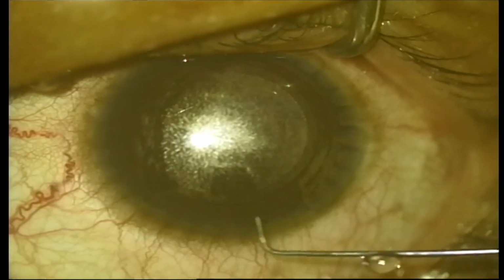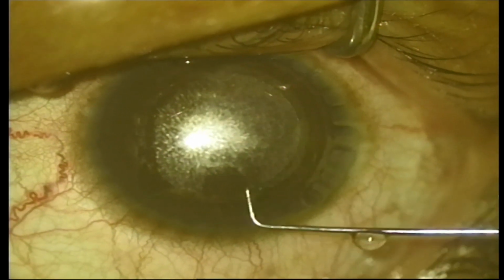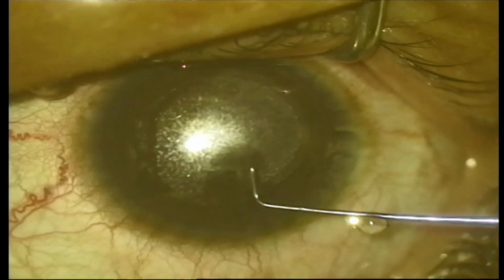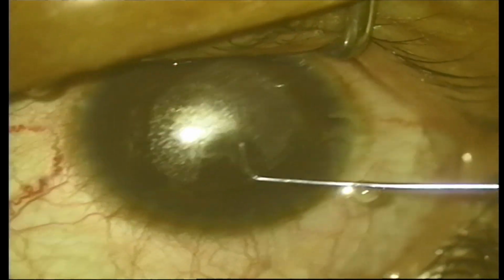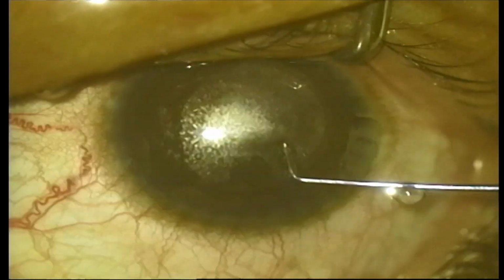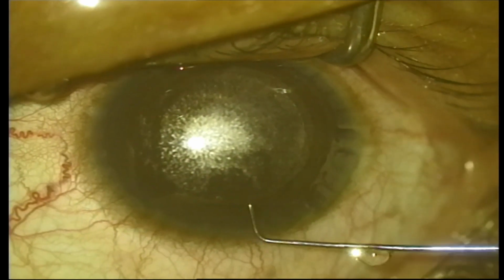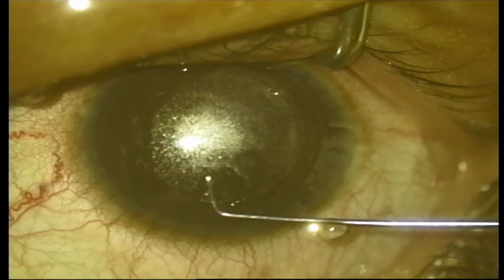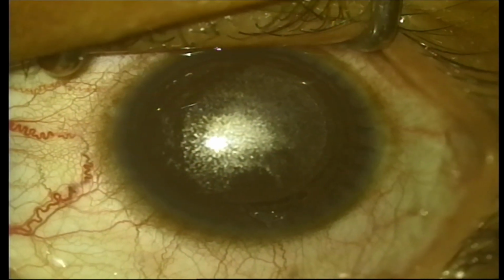Okay. And now I will go below the lenticule. So this is below the lenticule. You can see here, this is called the stop sign. Can you see there is a resistance here, Namrata? Yes, sir. So this is the stop sign, described by Gitansha et al. This is the meniscus sign, where you can see a meniscus forming.